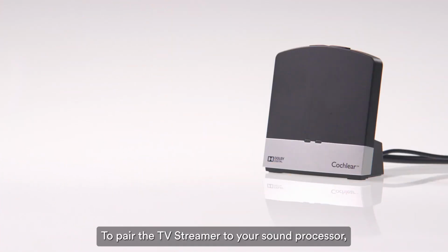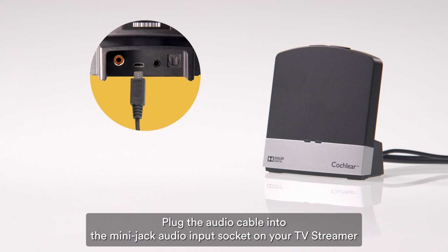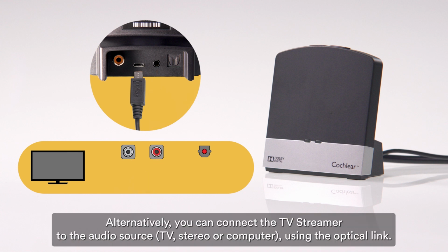To pair the TV streamer to your sound processor, first plug the power cable into the micro USB socket on the rear of your TV streamer and connect it to a wall power outlet. Plug the audio cable into the mini jack audio input socket on your TV streamer and connect it to the audio source, TV, stereo, or computer. Alternatively, you can connect the TV streamer to the audio source, TV, stereo, or computer using the optical link.